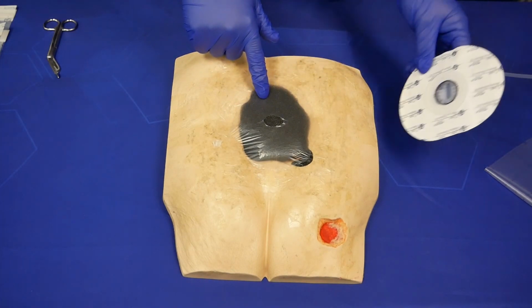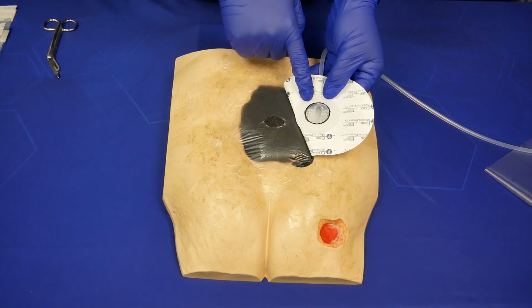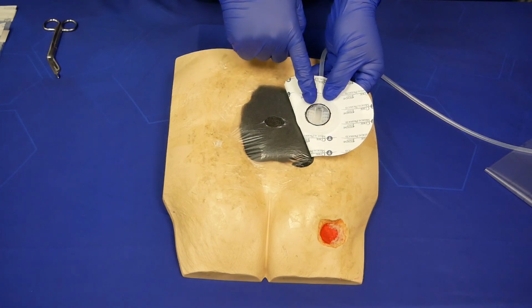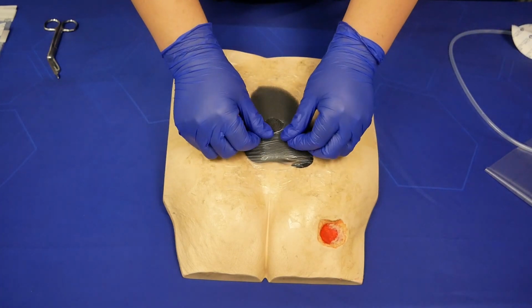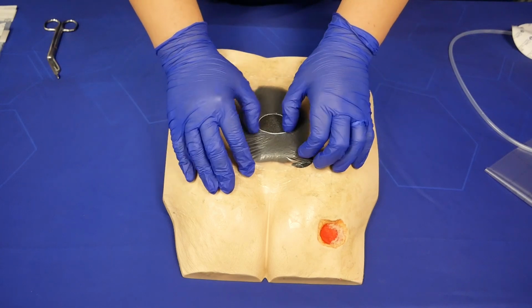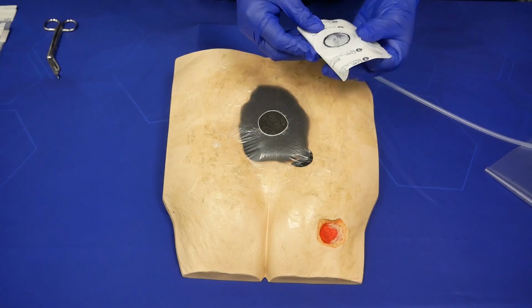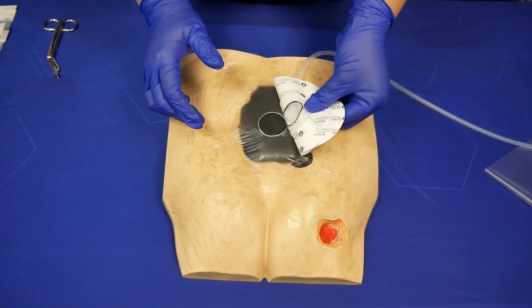However, you always want to double check the hole size against the hole under your port pad, because the hole that you cut in your dressing should match the hole under your port pad. So we can tell here that these do not match. Well, we can fix that easily by rolling our edges out like so. And then we can come back in and double check ourselves by doing this side-by-side comparison.